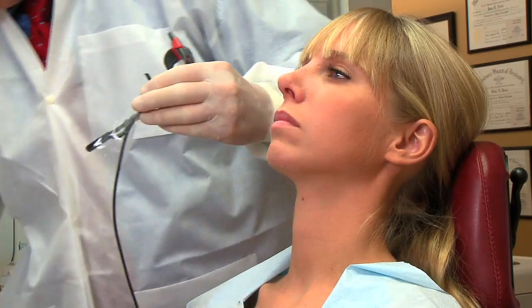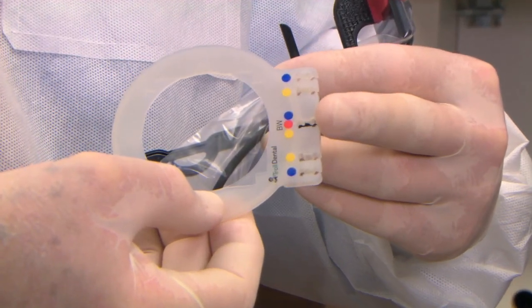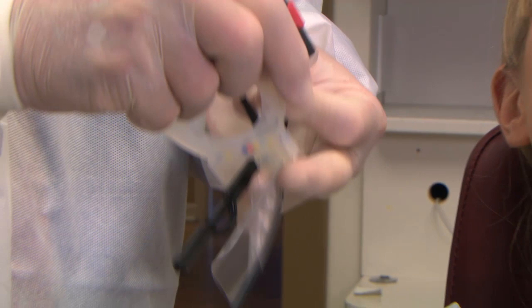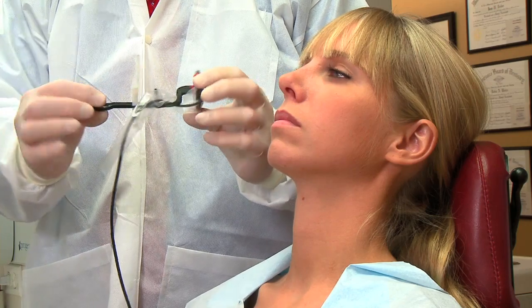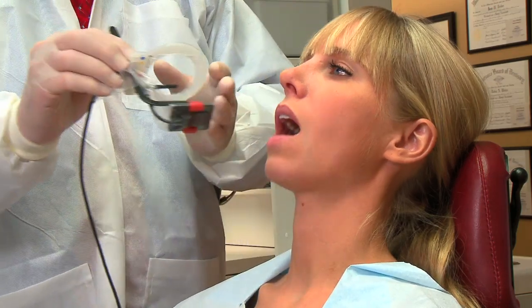The aiming ring is color-coded, the dots indicating the location for each holder and image position. The red dot is for the bitewing position. You slide it on until it snaps into place. You can move the ring along the arm. We recommend that you move it as close as possible to the sensor. Then you're ready to do the bitewing images.